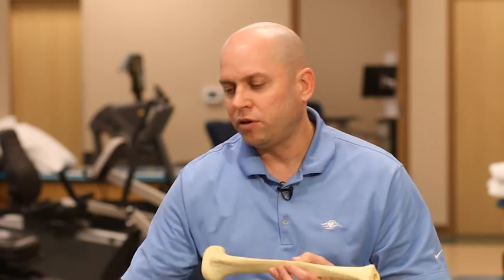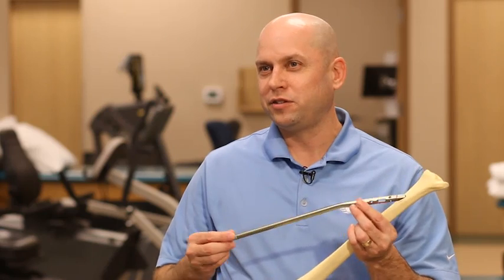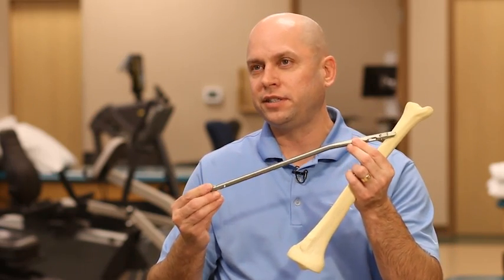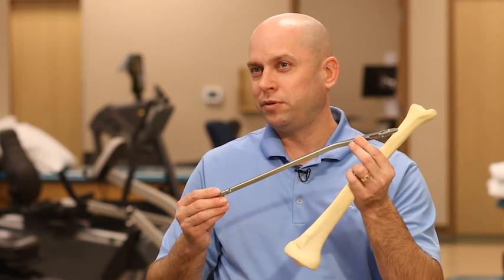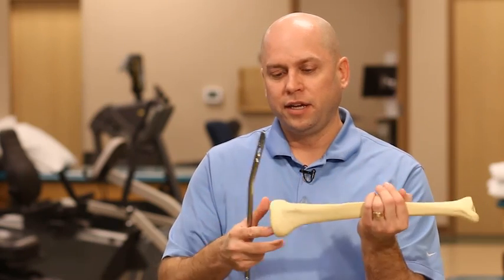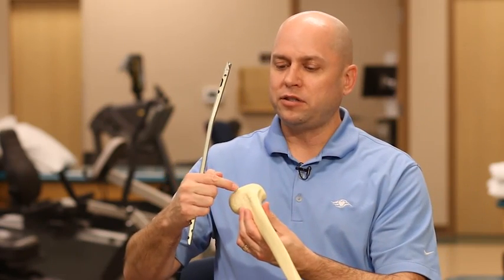But then a really smart orthopedic surgeon invented something called the intramedullary nail. This is an intramedullary nail that's very similar to the one that was put in Mr. Silva's leg, and you can think of it as sort of an internal cast.